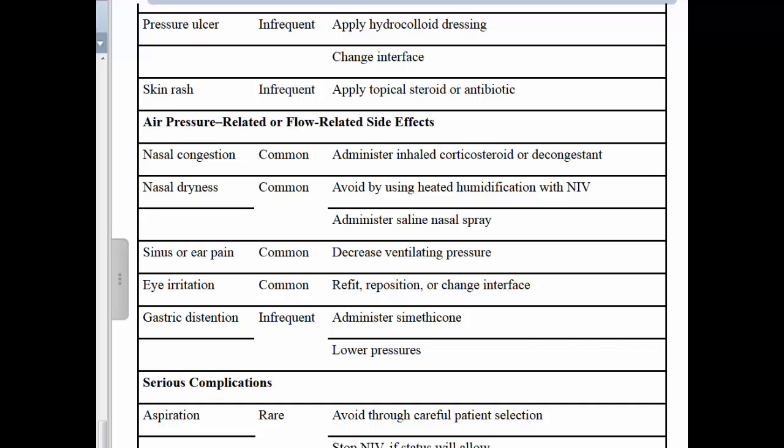The nasal congestion. Now this is something that I'm not aware of. If anything, the pressure relieves the nasal congestion because I don't wake up with that at all when I use it. Where if I go camping or something and I don't take my CPAP machine, I'll wake up sometimes with nasal congestion, that edema that you get first thing in the morning, but I don't get that using my CPAP.